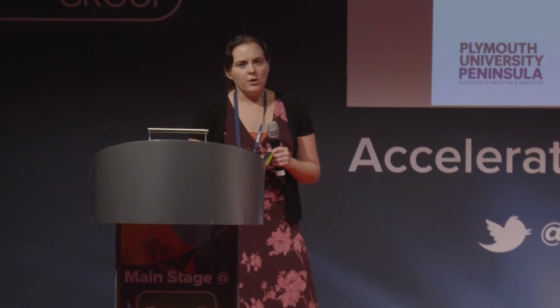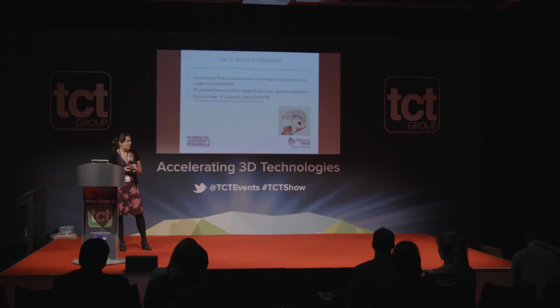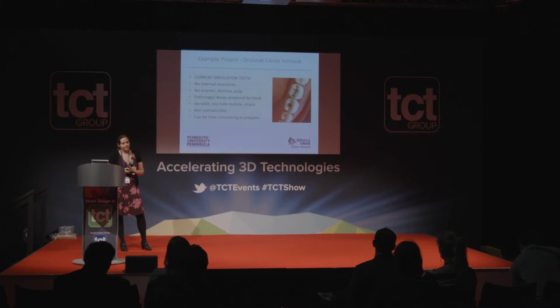This was a neurosurgeon who was aware that his trainees weren't getting enough practice of pediatric neurosurgery. Surgeons often practice on cadavers, and obviously there's a shortage for pediatric practicing, so they needed to make a model that they could practice these procedures on and build up their experience. And so they used 3D printing to create a pediatric skull for them to practice on. So we started to think that this could be something we could use.